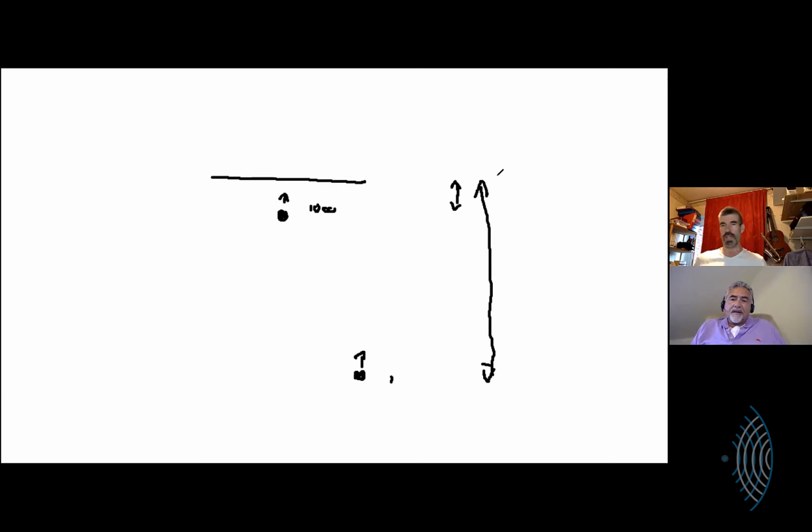It goes on in the machine and works in the background. What you often have on a device is a bunch of sliders going all the way down. You'll have seen on the large devices, there's a bunch of sliders down the side of the machine. That allows you to change the gain at any particular level in the screen. Yes, like an equalizer sound thing. Yeah, okay, I'm with you.